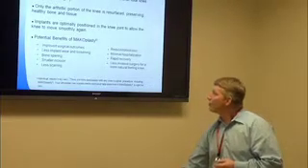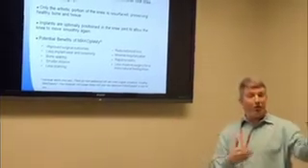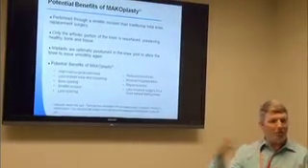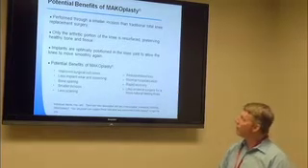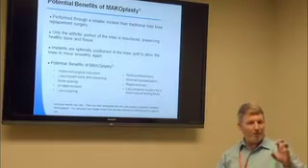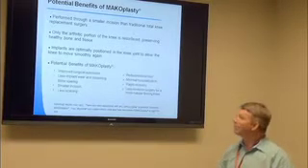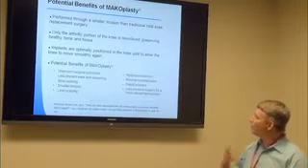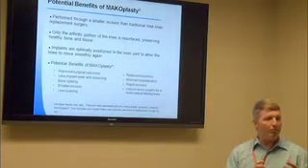I don't think that will come up. So what are the benefits of doing this? Have we seen that this is beneficial to our patients? That's the most important thing as a surgeon. Are we getting any benefit from this fancy technology? Typically what we see is that we are able to perform the surgery through a smaller incision than a traditional knee replacement surgery. Only the arthritic portion of the knee is sacrificed. We help preserve the healthy bone and tissue. The implants are positioned where we need them to be, so they're optimized with regard to their position and placement, allowing the knee to perform like it should perform.